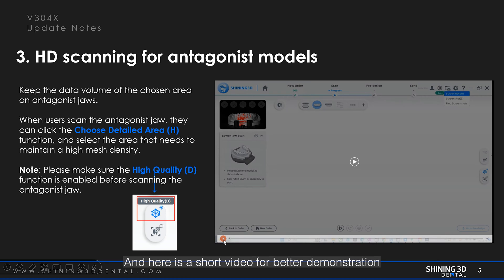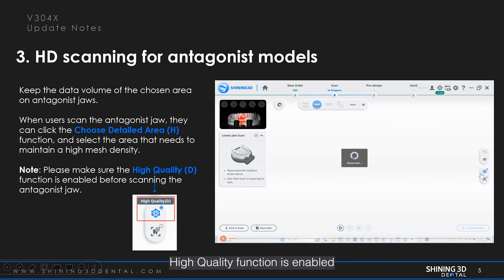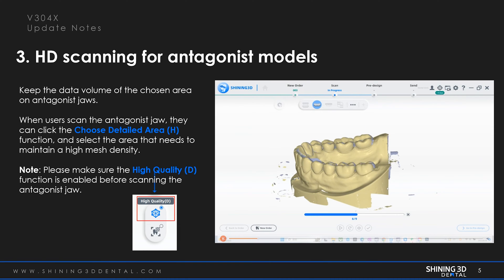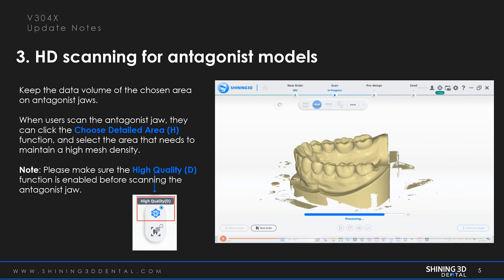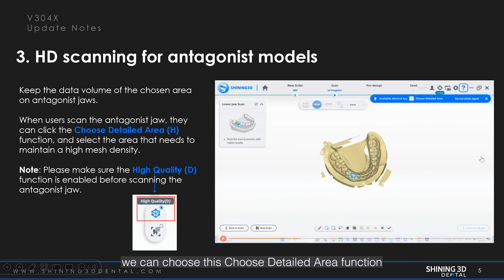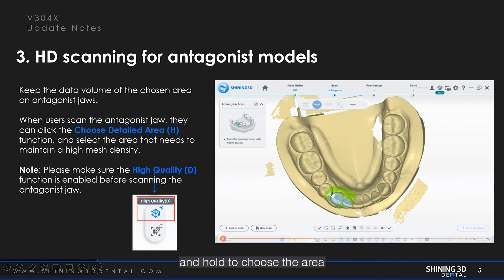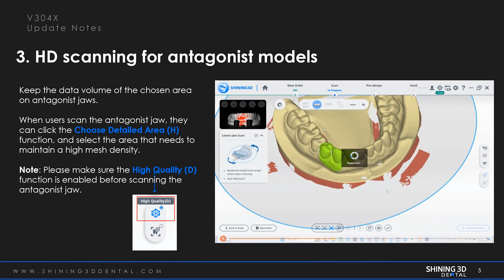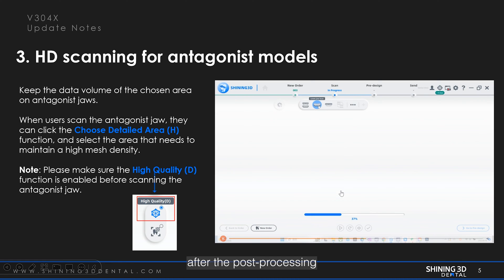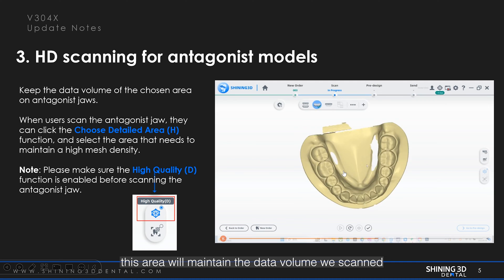Here is a short video for better demonstration. As you can see, the high quality function is enabled and now we start to scan the antagonist arch. When the scan is done, we can choose the detailed area function and single-click and hold the mouse to choose the area where we want to maintain the data volume. And the area is chosen.